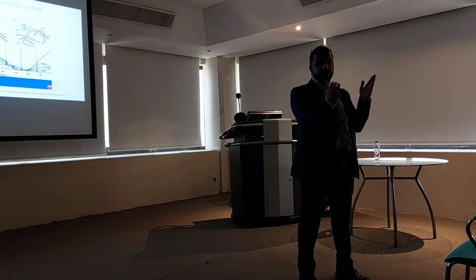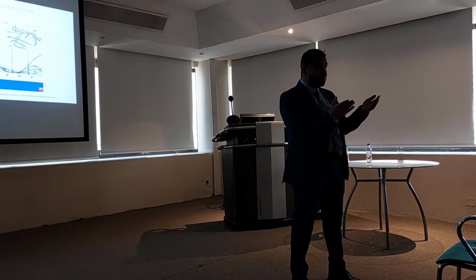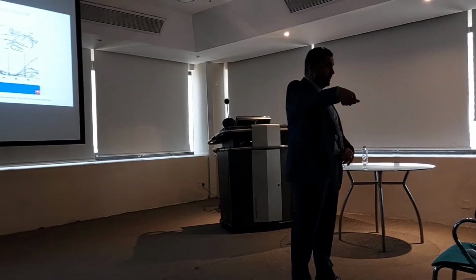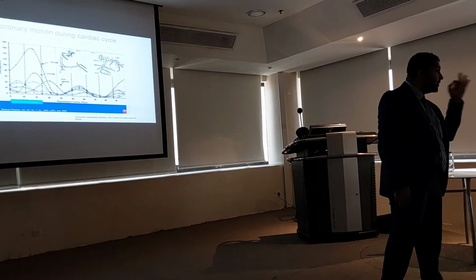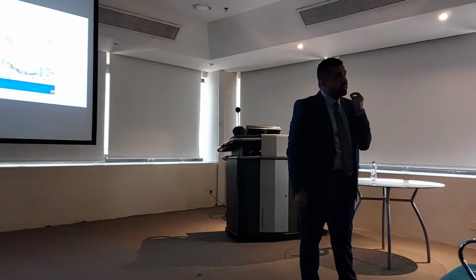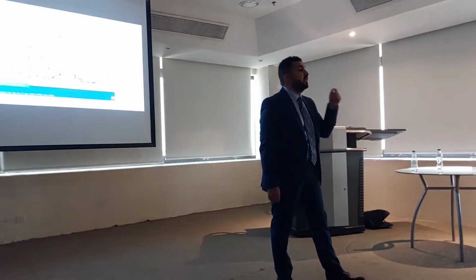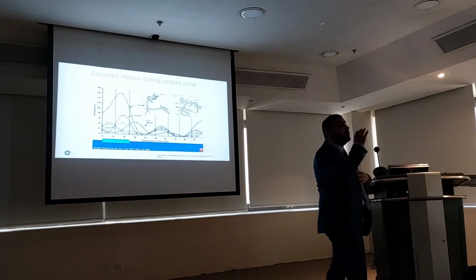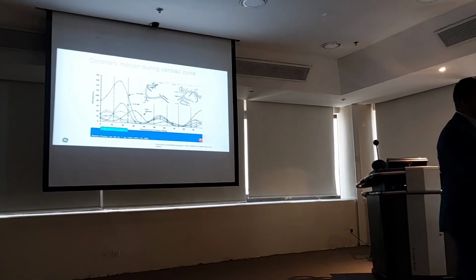Angulation 0.5. I will show it. 0.23 again, because I was busy, so I did not hold it enough. Sometimes it's not an accurate zero, because cardiac is a very, very accurate procedure. It will give me issues. It should be zero. It should be 100% guaranteed.